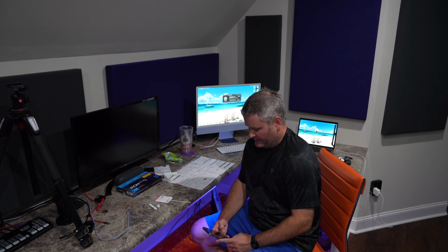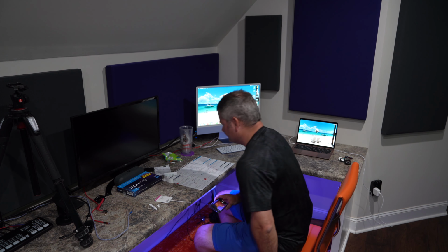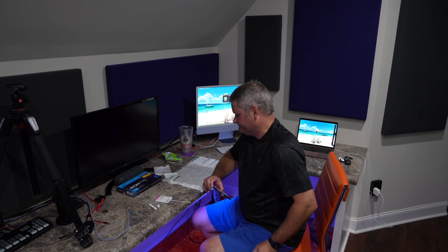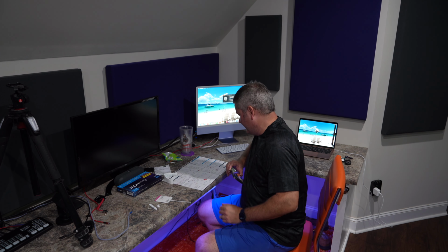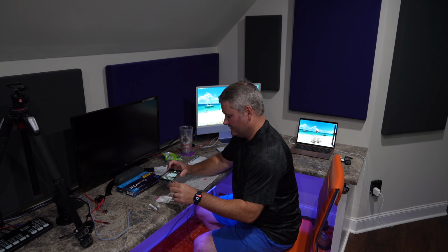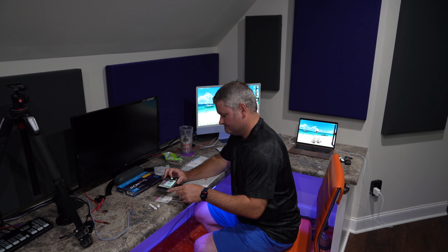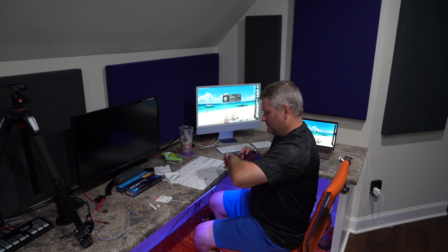Okay, so my 15-minute timer is about to go off, and I'm going to take a photo of this as well, so I've got my test result properly documented. Hey Siri, how much time's remaining? 7 seconds. And it said, read the result at 15 minutes. Here we go. That's 15 minutes. So I've got my result documented there.